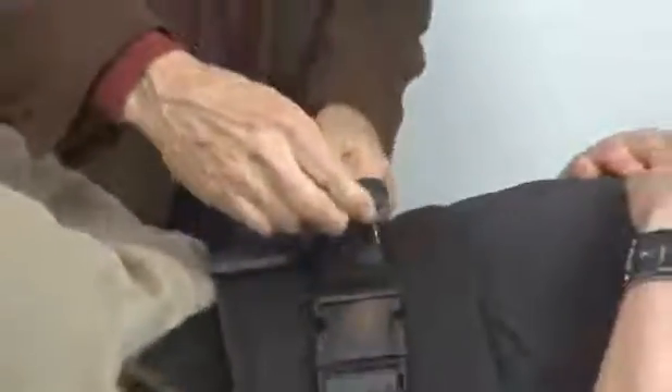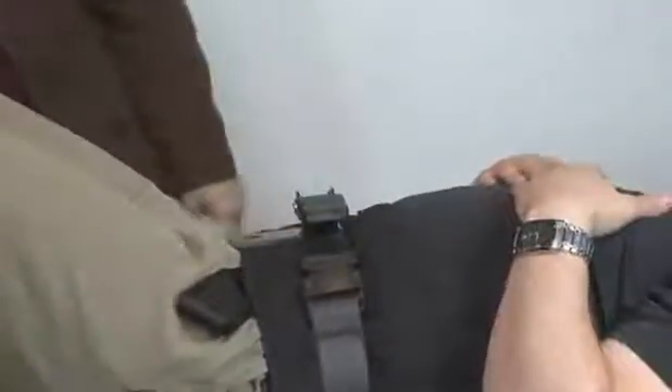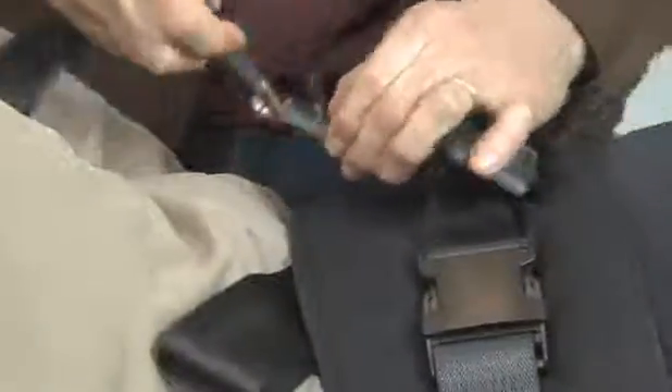Once we reach that point, we begin ratcheting — usually only four to five ratchets are sufficient to get it controlled and fully tight. We then add the tail strap, which has a hook into the bar and hole, and now we're ready to begin traction.